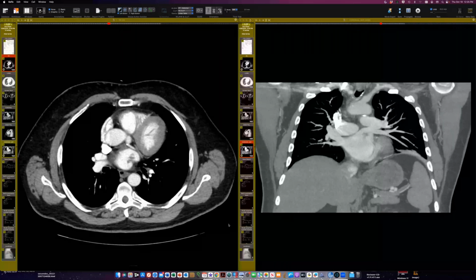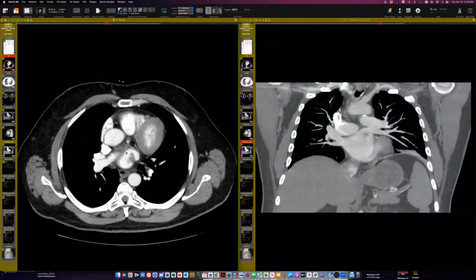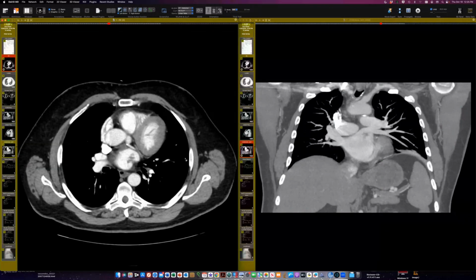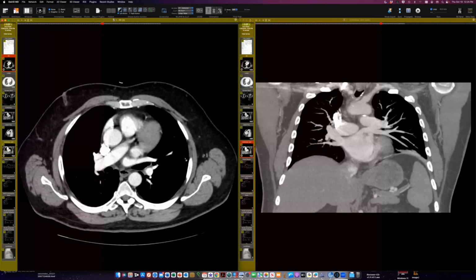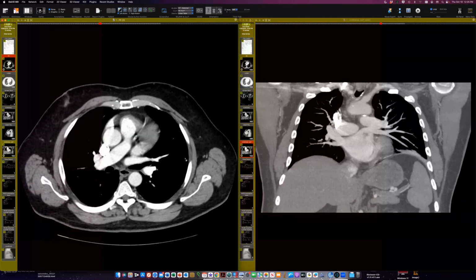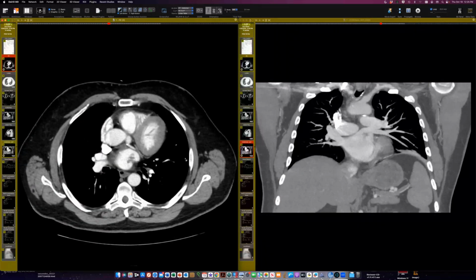Yes. This person had a CT PE protocol at an outside hospital and has this bizarre filling defect in the left atrium on this view. I've never seen anything like this. It doesn't really seem to connect up with a pulmonary vein. The pulmonary veins are densely opacified, so I don't think it's an inflow defect. It looks kind of polypoid, so it looks bizarre to me. And then here it is on coronal.